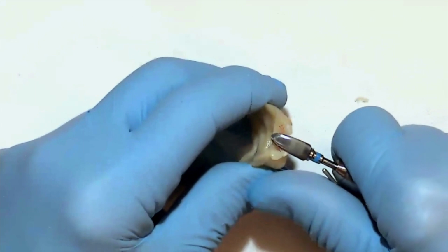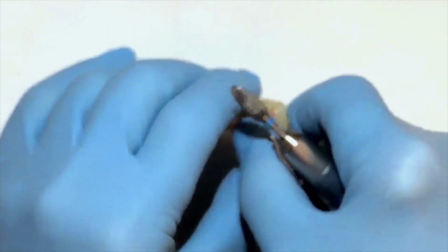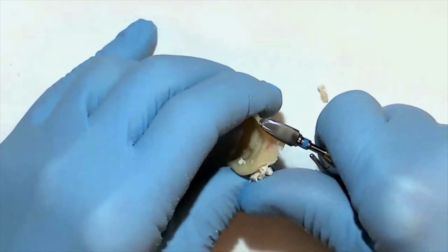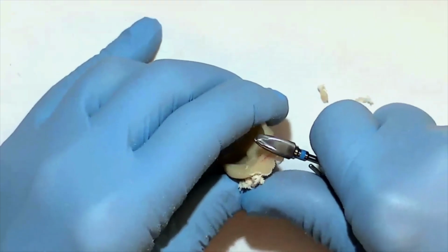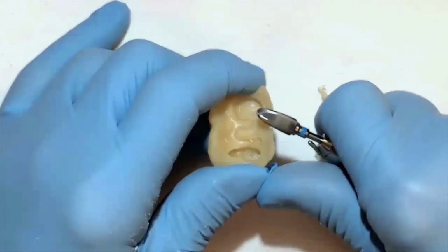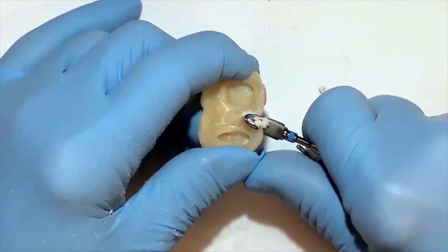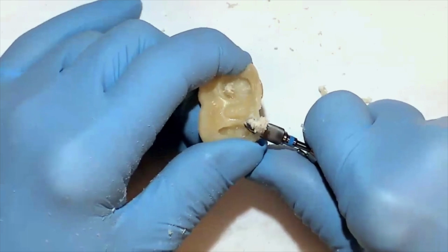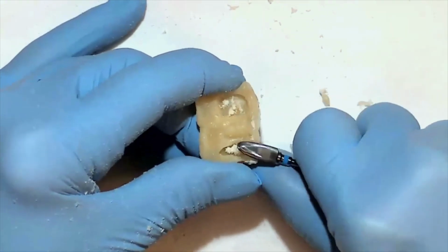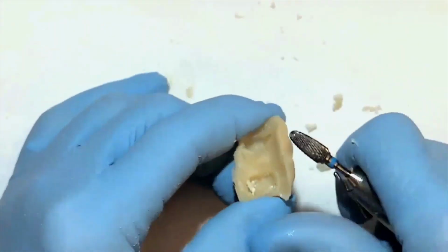We're going to go over the interproximal areas, maintaining that red area where the contact was, but trying to create proper contours, especially at the gingival area. Now we're going to start removing some of the excess acrylic on the underside and the lateral side down to within a millimeter or so of the actual margins of the preparation. We'll do that on the buccal and the palatal side.